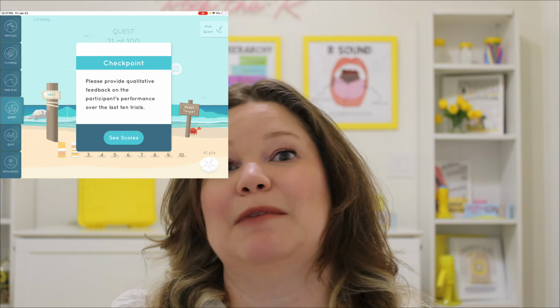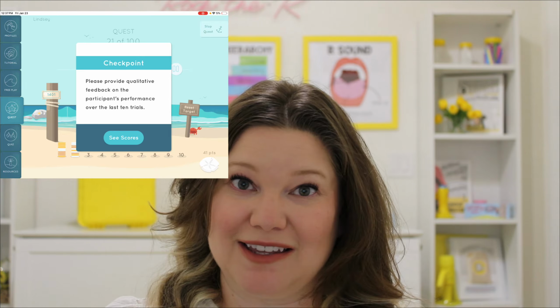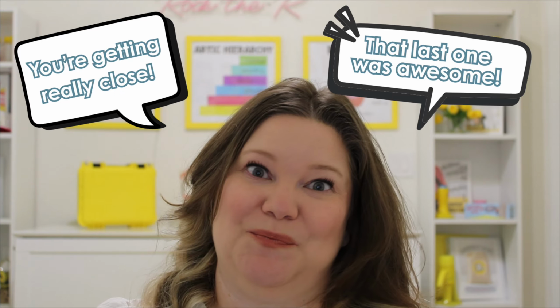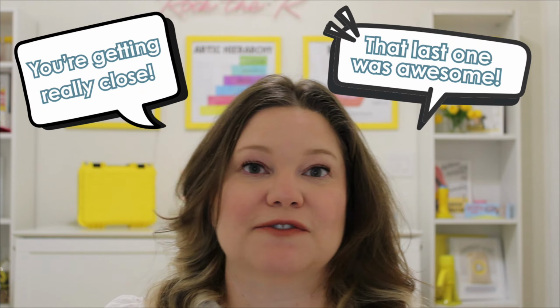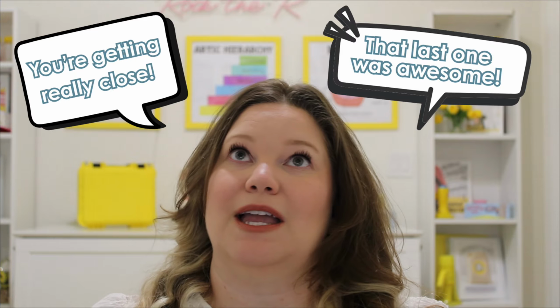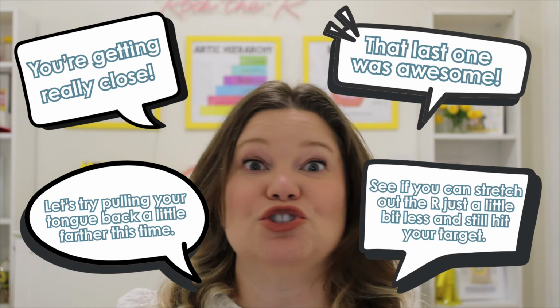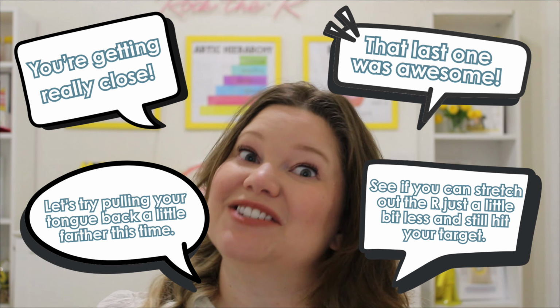Practice happens in blocks of 10. After each block of practice, that is your cue to step in and give a little bit more detailed feedback. You can reflect on how practice went. For example, you could say something like, "You're getting really close. That last one was awesome." Or you could suggest some changes for the next round, like saying something like, "Let's try pulling your tongue back a little farther this time." Or see if you can stretch out the R just a little bit less and still hit your target. It's quick, collaborative coaching, and it helps the next block feel purposeful and not repetitive.